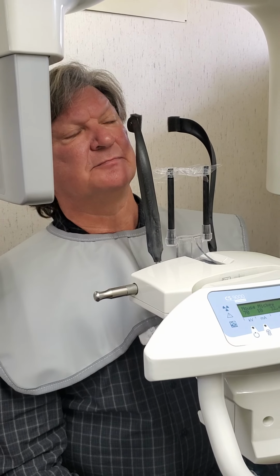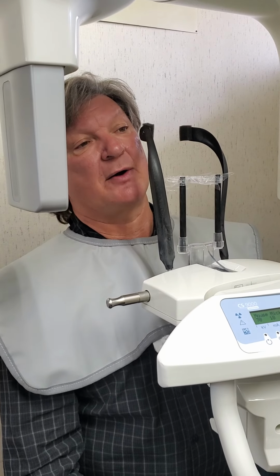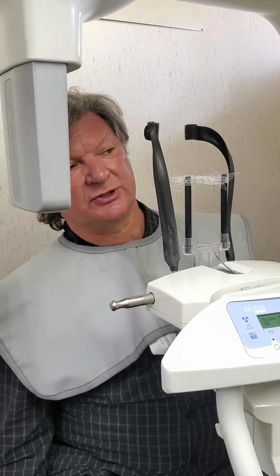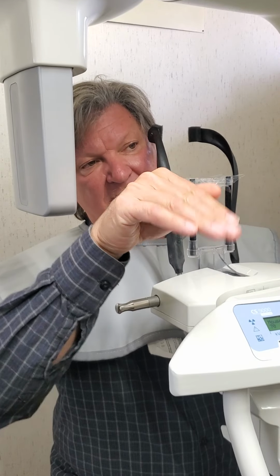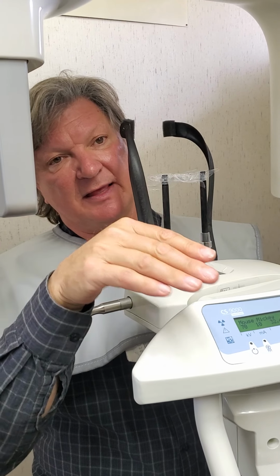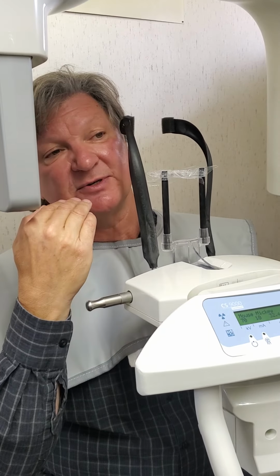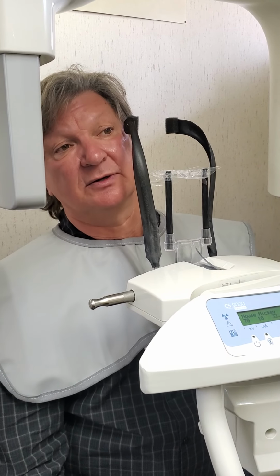Mm-hmm. Oh yeah. We could do that without my head actually in there, but then you wouldn't know if it came out okay. But if we took one, I could show you, and Dan could show you, what happens to bad X-rays, how we get tipped, and we don't end up with our teeth on there. But we want a good X-ray. It won't do us any good if the cusp tips are missing. So we have some things that are important to us, you know.